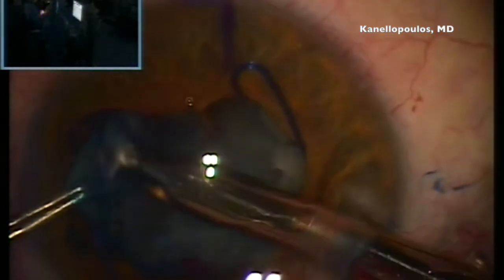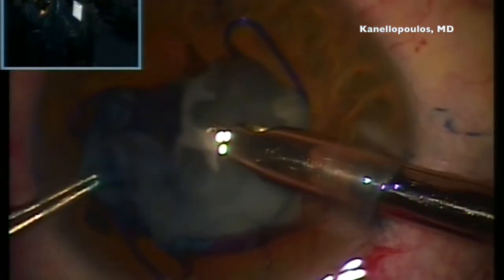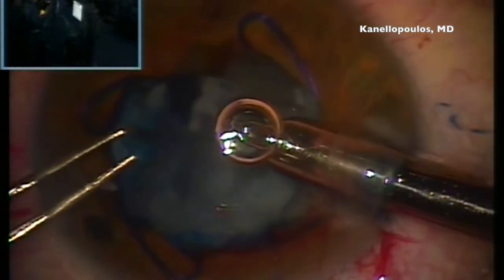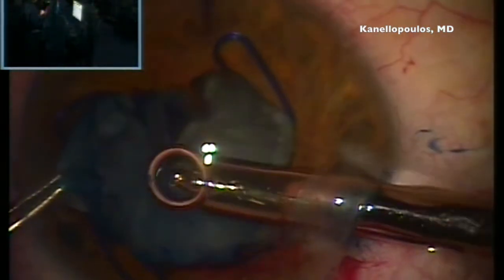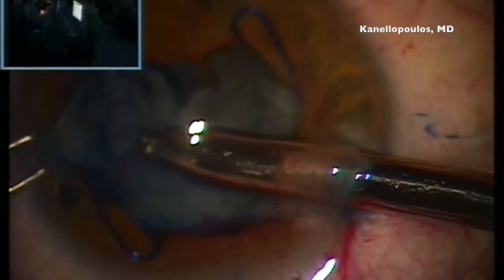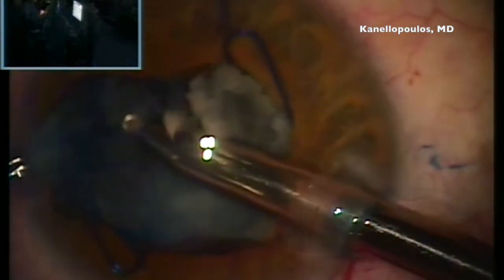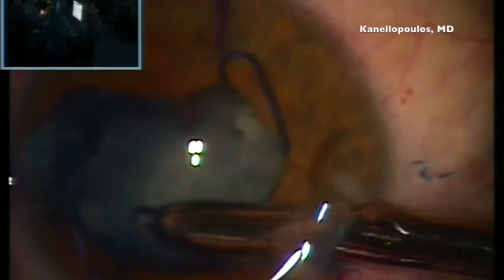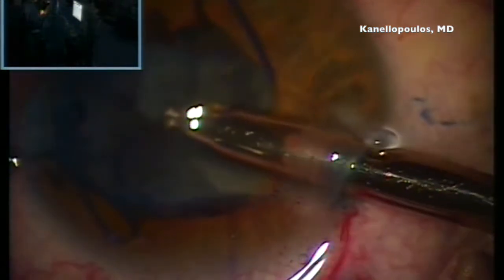We're seeing here that I'm not using my phaco tip, I'm just using my irrigator aspirator, and I'm able to perform just an irrigation aspiration removal of whatever was left from this intumescent cataract. So this is the reason I decided, this being a very particular case, to go real time in the manipulation, and I'm working manually.